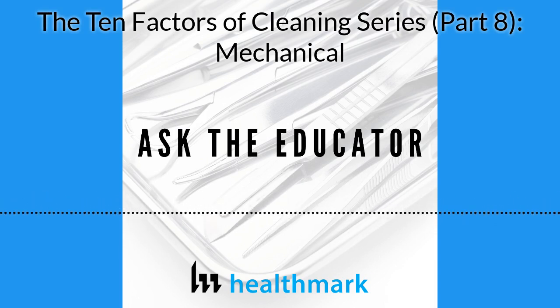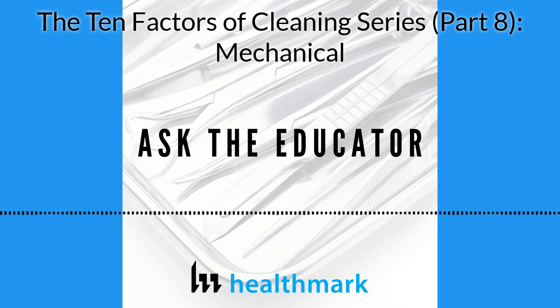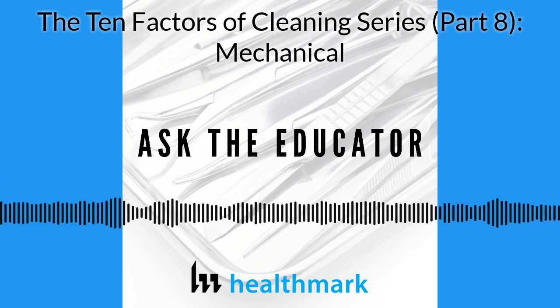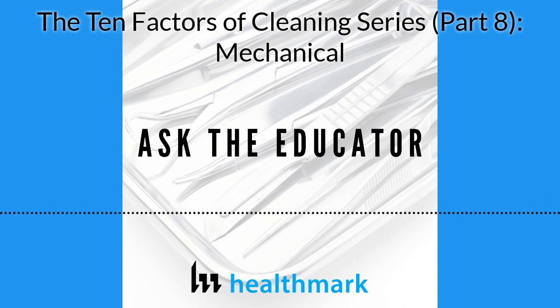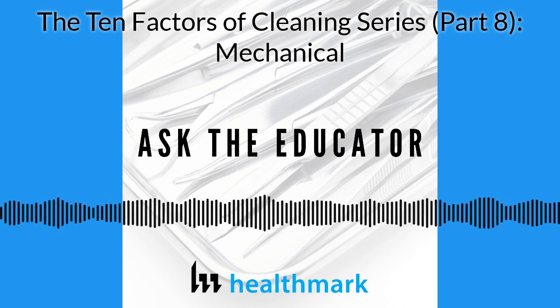Everybody makes different sonics. Some have one pump that divides that water pressure through 8, 12, or 16. And you've seen it, Kevin. We've got some videos where the more you hook up, the less water goes through. Think of your faucet outside. You have one hose, you get a lot of pressure. You see some of these faucets that you can hook up 4 hoses. It's the same amount of water coming through, but it's now being divided 4 ways.